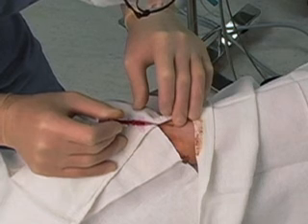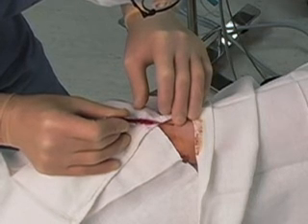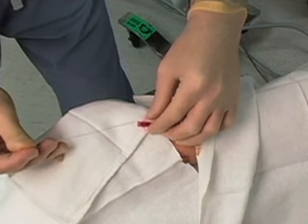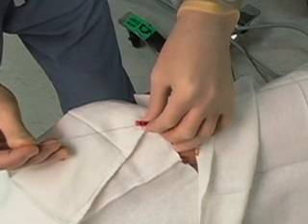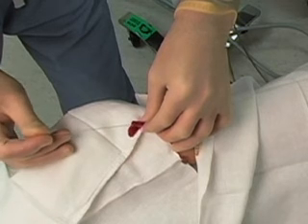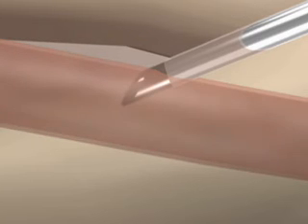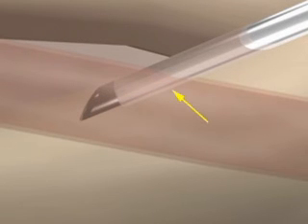If, in the over-the-needle technique, no blood return is obtained after the initial flash, the catheter can be advanced through the vessel and the over-the-wire technique can be employed. Occasionally, free flow of blood is observed, but the catheter will not pass easily. In the animation, you can see how the tip of the needle might be within the vessel, while the catheter remains outside.